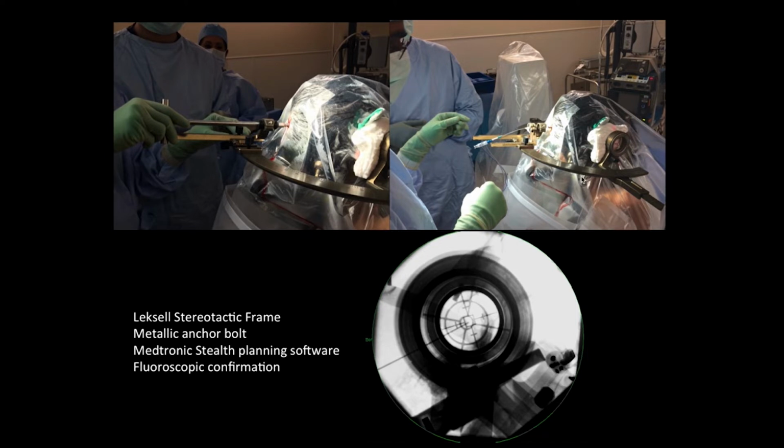This is an apparatus that gets attached to the patient's head. There are little markers on the sides of the frame that allow us to then take an X-ray to confirm that our laser probe, which is this line here, is right in the center of this little circle and this little square, which confirms precise placement. Once the probe is placed, the patient is then taken to the MRI scanner.